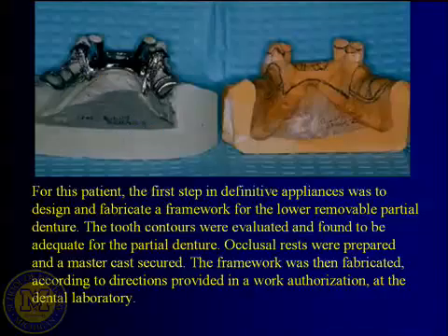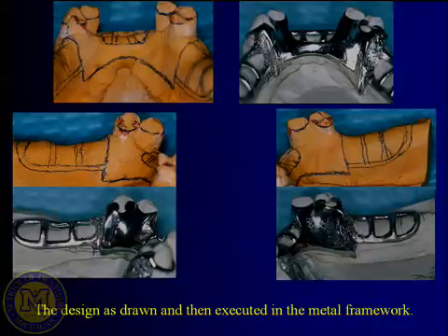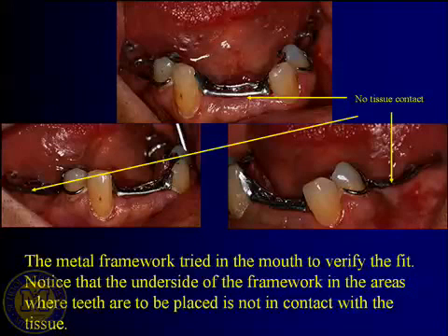So where you contemplate having the lingual plate fit around here, where you're going to have your lattice work, if you go ahead and look at where the clasps are going to be. So did the buccal surface of this tooth need any reshaping to allow the clasp to stay low toward the gum line? Ditto over here. Did the buccal surface of the tooth take any reshaping? And so you want to make sure that your tooth modifications have been made so that at the time you go ahead and want to take jaw relationship records, you have a partial denture framework back.